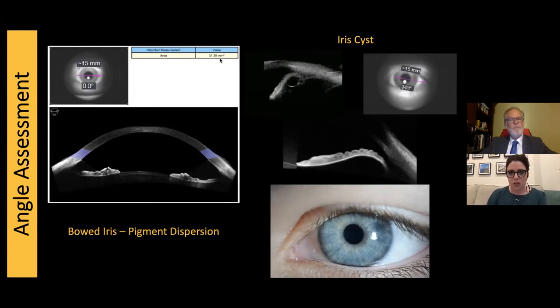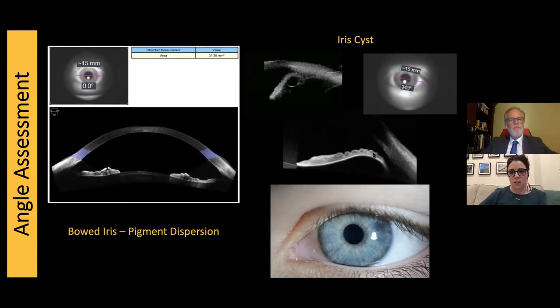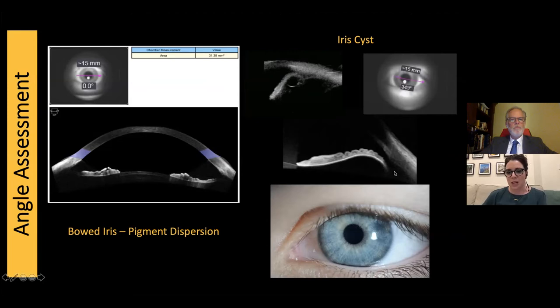Another interesting use of anterior segment OCT is for iris cysts. This is a young lady — this is the UBM of her iris cyst, and we can see it very nicely on the anterior segment OCT as well. We've been repeating this frequently to make sure it's not changing in size. The patient is 12 years old — getting a UBM with contact on the eye is very difficult. The OCT is obviously a much less invasive way to image the same patient.